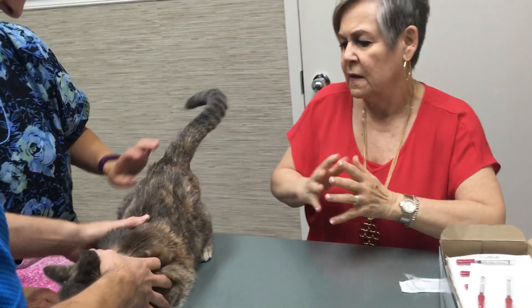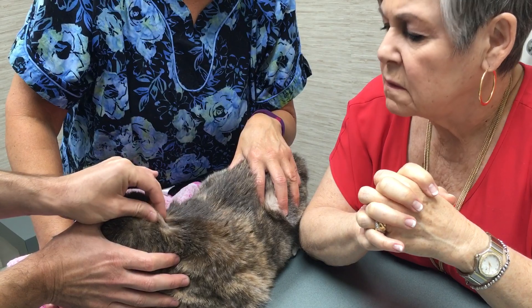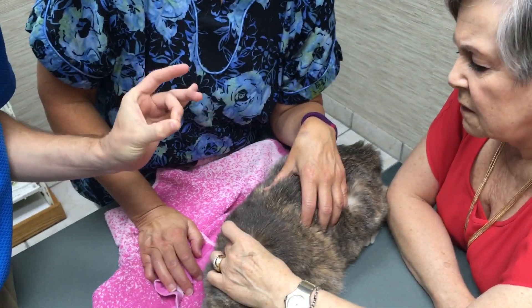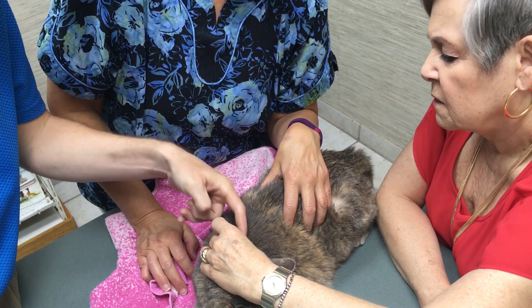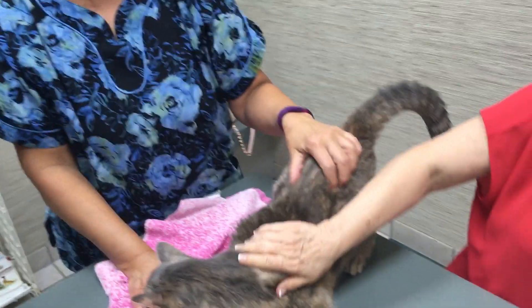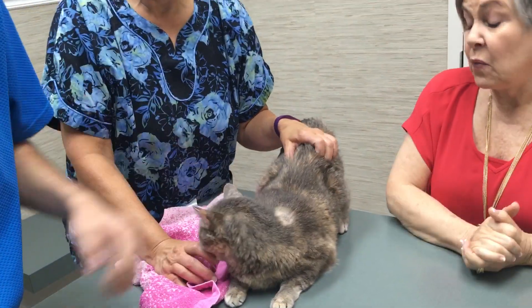I'll show you one more time. When I pick up, I actually use my middle finger and thumb to pinch the skin. And if I don't get a good pocket, then I use my index finger to just touch down and I end up having that little pocket I want to aim into. Middle finger and thumb — if you don't get a good pocket, touch with your index finger and push down right there. You're just aiming between your finger and thumb at a 45 degree angle down. And please don't give yourself the insulin. You're going to do fine with this.